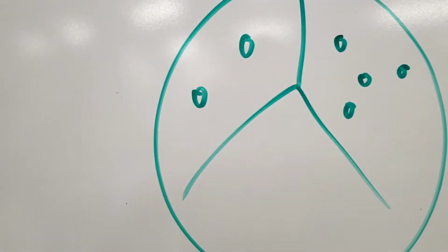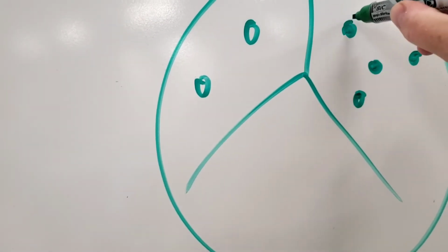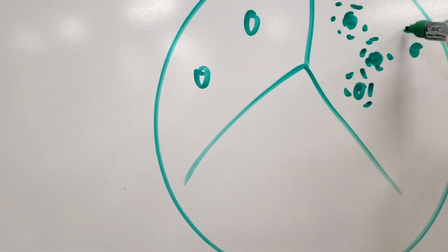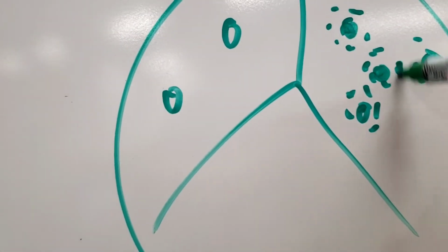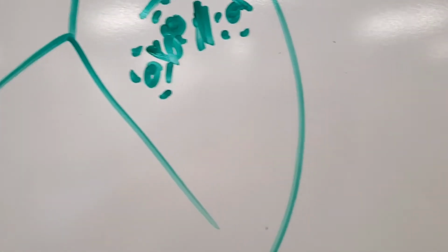What you're looking for when you put the samples inside the wells is that the samples are going to start migrating out through the gel in the well in all directions. And as they do that, they're going to interact at some point, right? Let me take you back now to my.